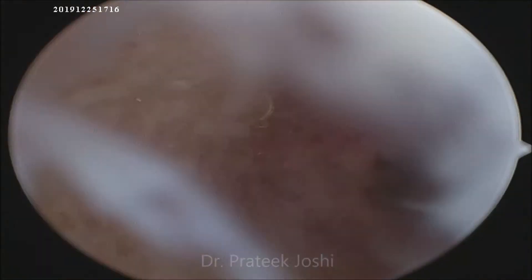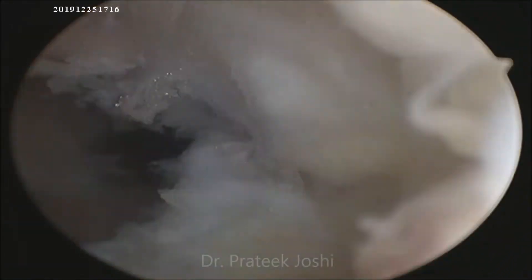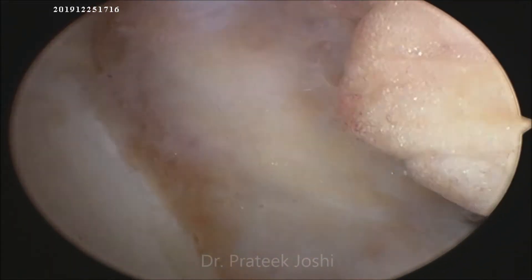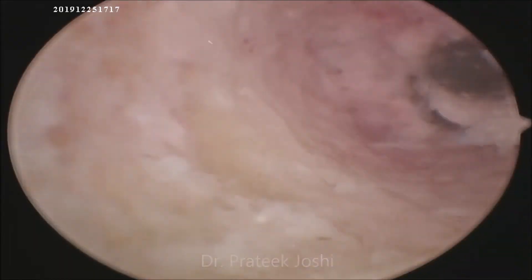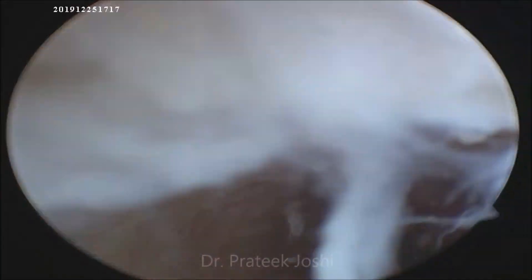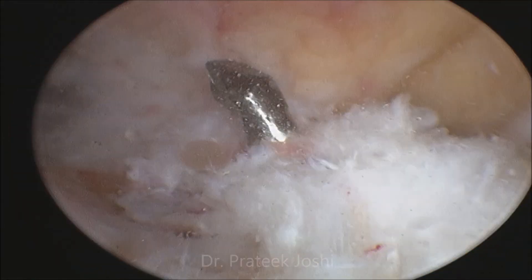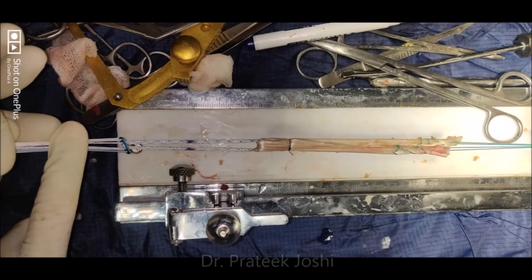Here we are seeing the femoral tunnel from the anterolateral as well as anteromedial portal to confirm its anatomical placement. The tibial jig is used to drill the guide wire through the native tibial stump.